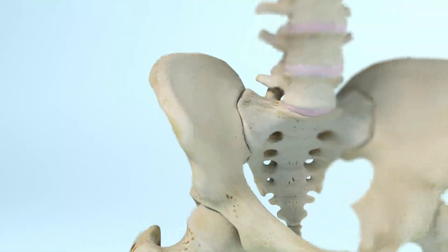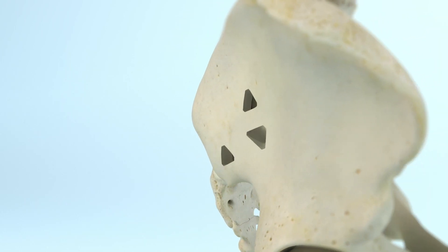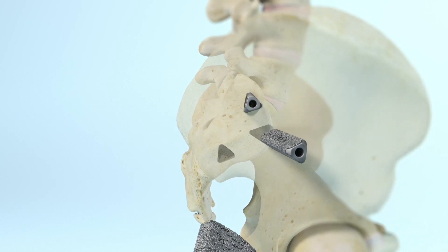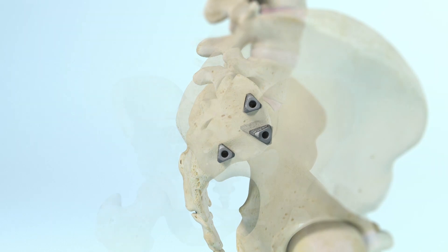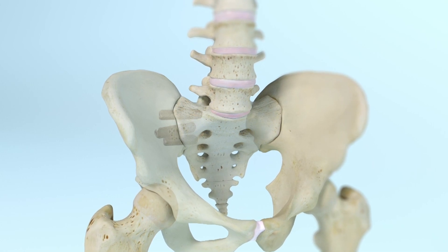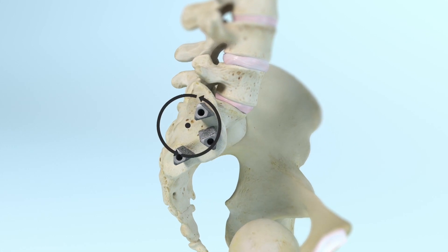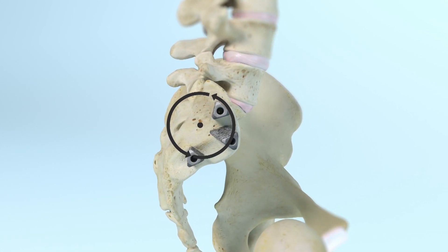Through a small incision of about 3 cm, typically 3 triangular titanium implants are inserted through a tissue protector in a lateral to medial orientation to transfix the SI joint. The transiliac procedure allows the iFUSE implants to be placed through the dense subchondral bone of the cartilaginous joint parallel to the axis of rotation and farther from the center of rotation to maximize biomechanical stability.